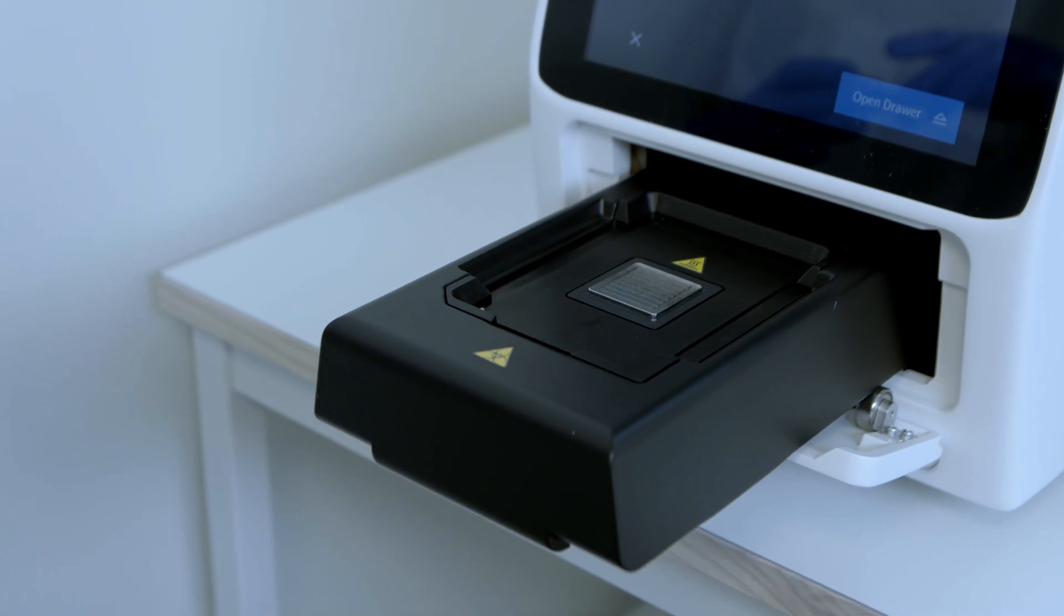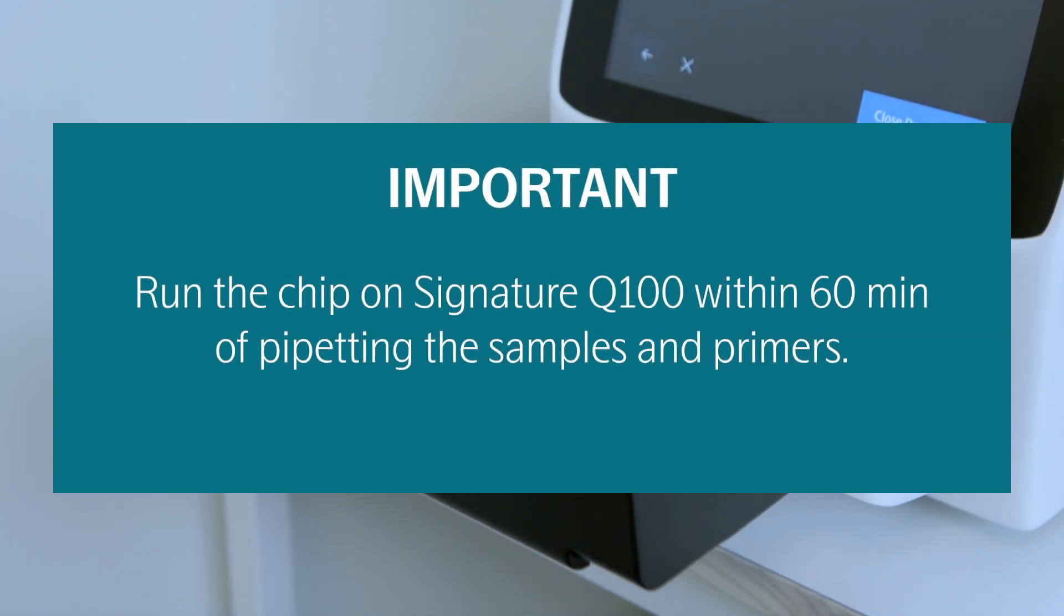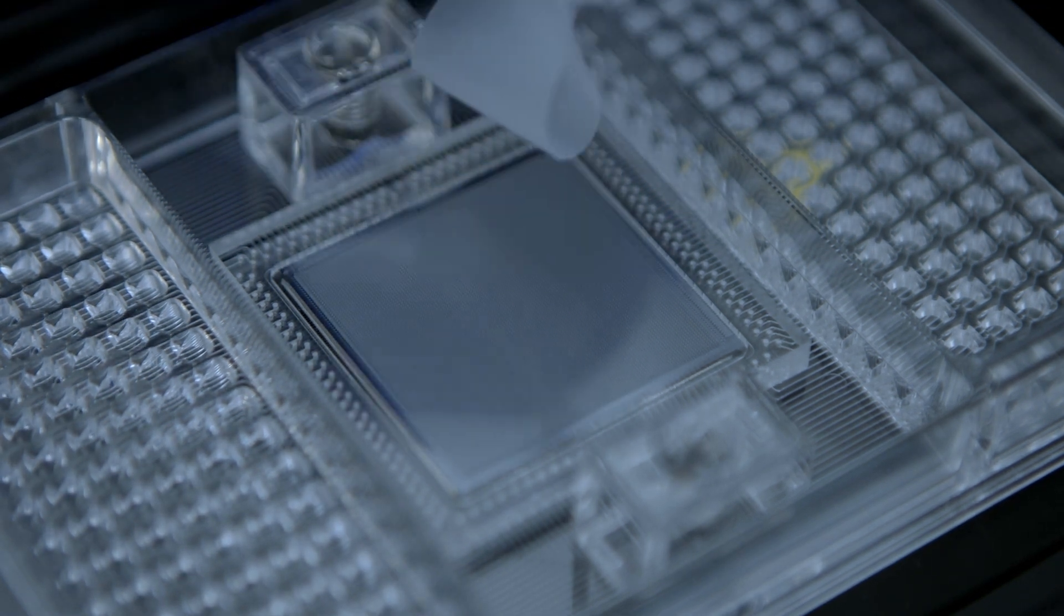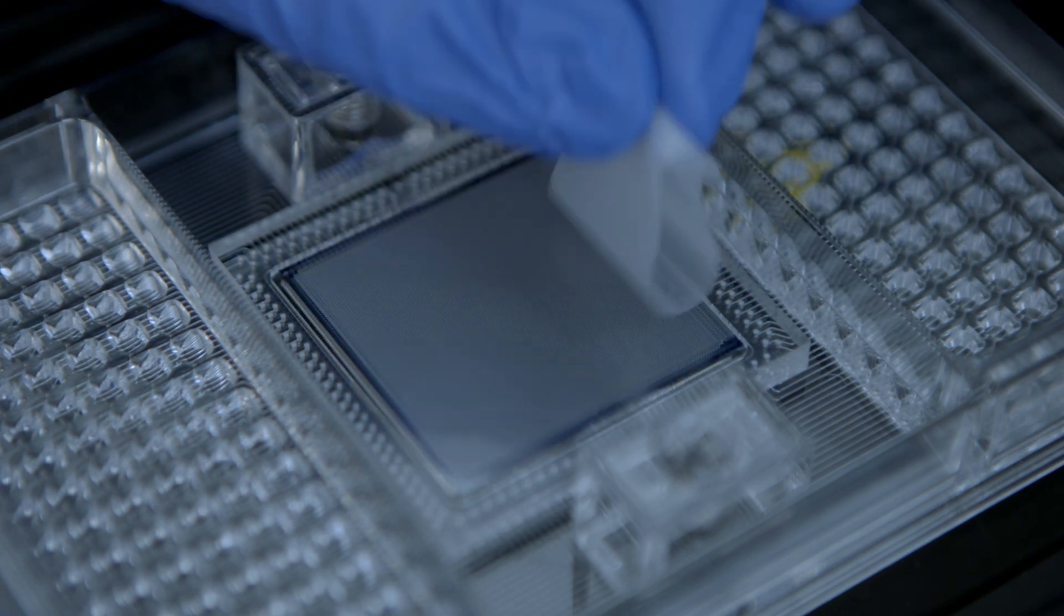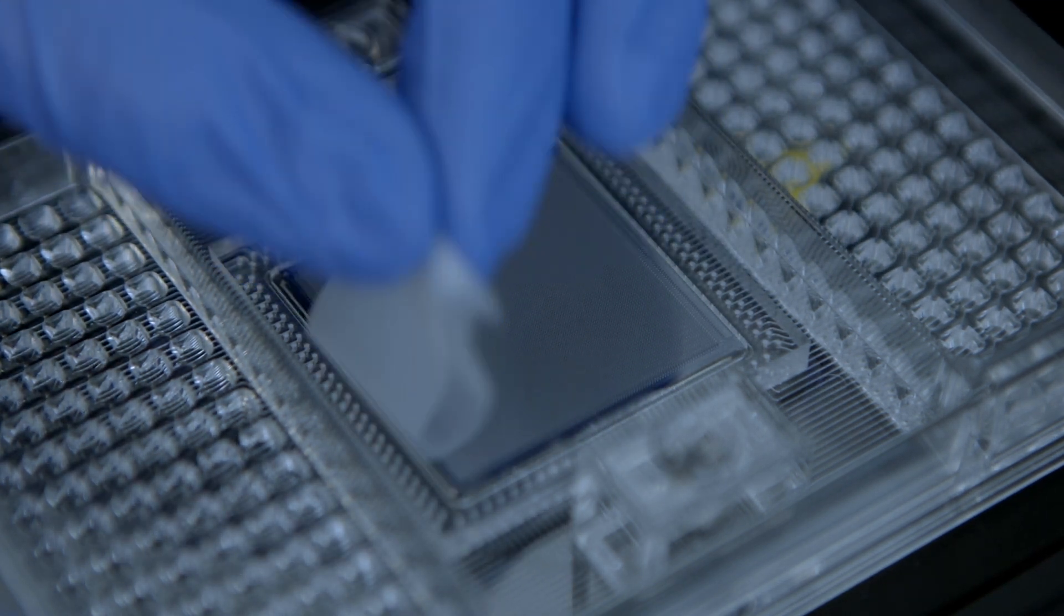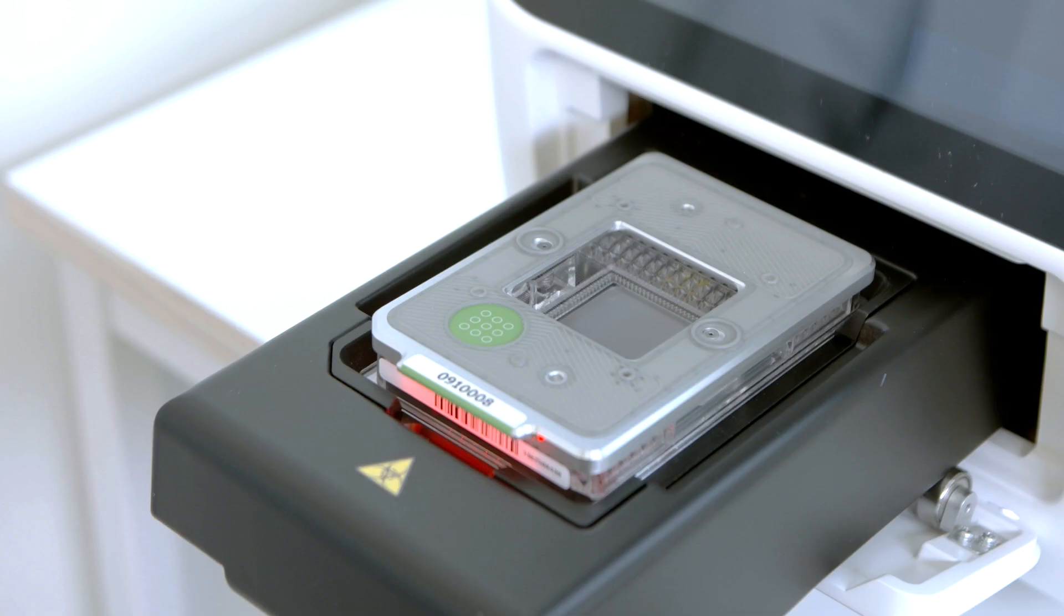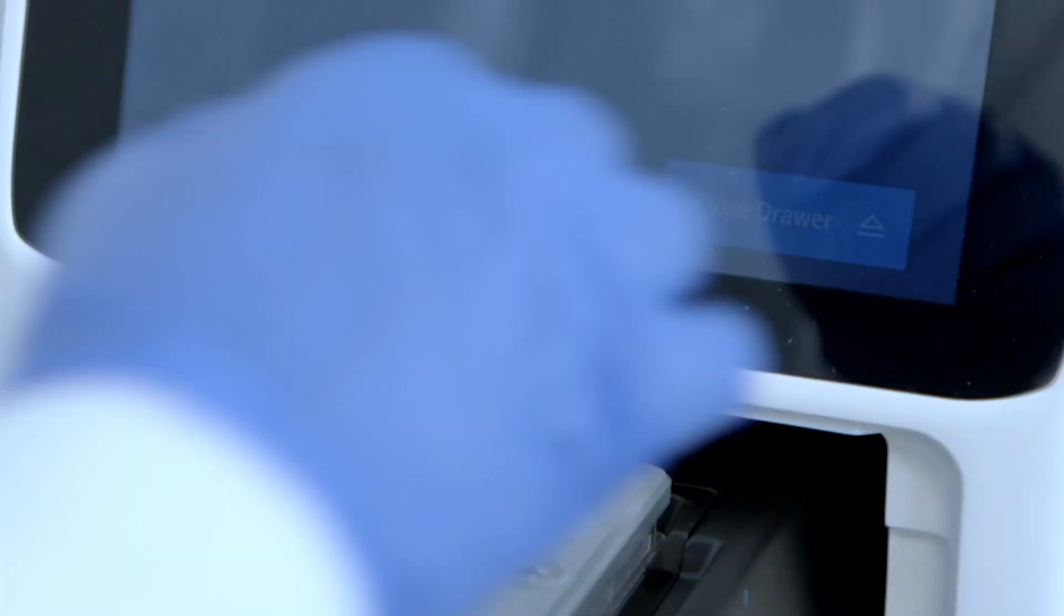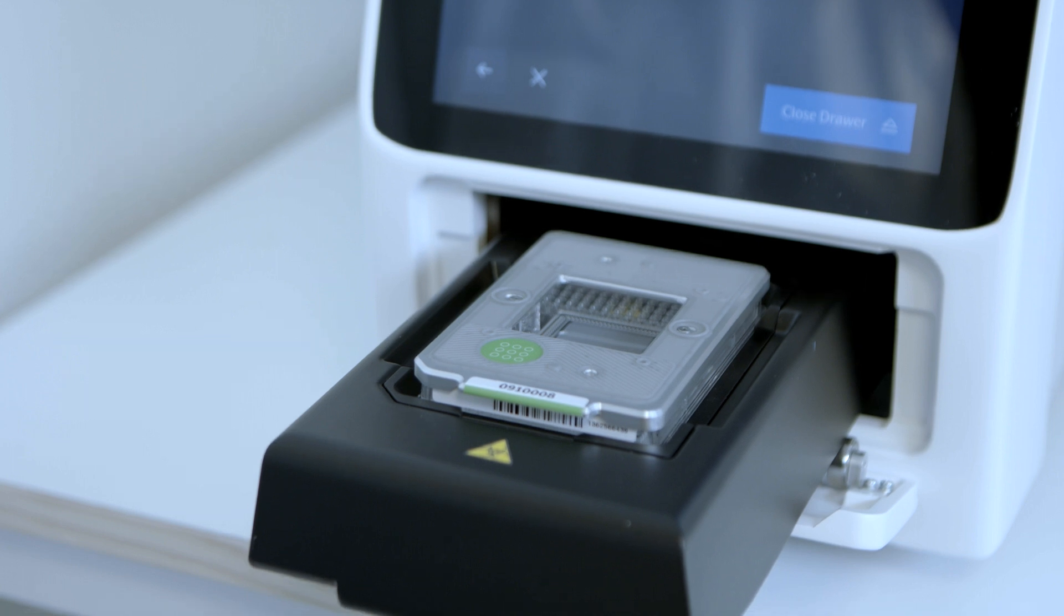With the Insert the Chip Containing Samples screen on display, place the IFC in the drawer. Use clear tape to remove any dust particles or debris from the IFC surface if necessary. Place the interface plate over the IFC. Align the notched corner of the IFC with the notch on the drawer, and face the barcoded edges of the IFC and interface plate forward. Close the shuttle drawer by tapping Close Drawer. The system scans the IFC and interface plate barcodes, then closes the drawer.